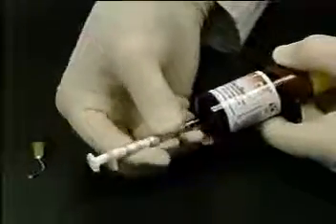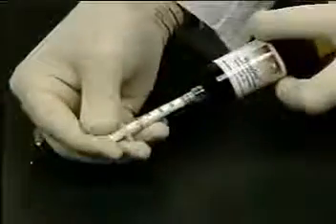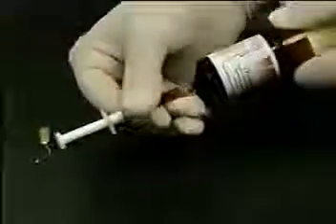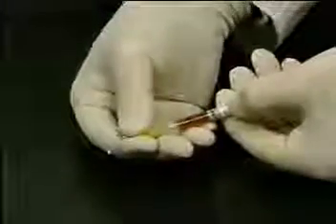This is accomplished by attaching a 1.2 cc syringe to the Indispense container and then filling with either Viscostat, Astringedent, or Astringedent X. As mentioned earlier, Viscostat will be used in this demonstration. A 0.3 to 0.5 cc volume of solution is usually adequate for one preparation.